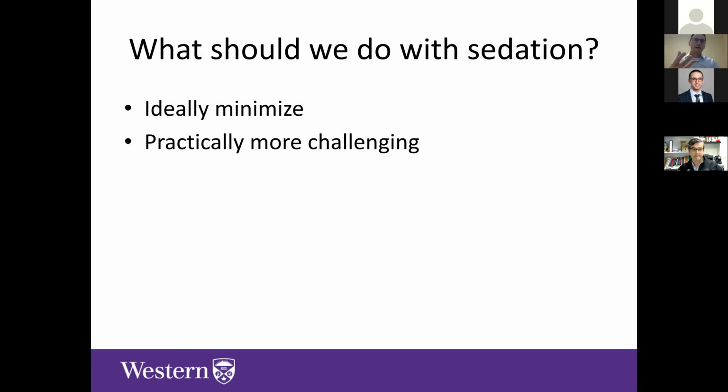And it's interesting that is part of the push to do early ECMO, is to actually avoid these truckloads of sedation that we get people on beforehand. Because that seems to be a factor, is they just get on so much sedation and analgesia that it becomes a challenge to wean it. So this is hard, but it is the goal. And then what we see as we wean sedation is flow variations and the hypoxemia that results from that. The ECMO circuit is very dependent on preload and afterload for maintaining flow. So if either of those things change, then flow through the circuit will change.